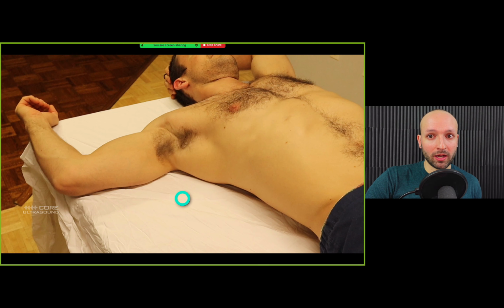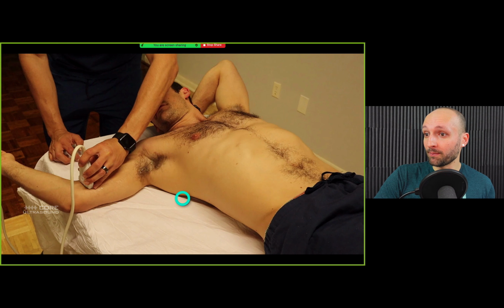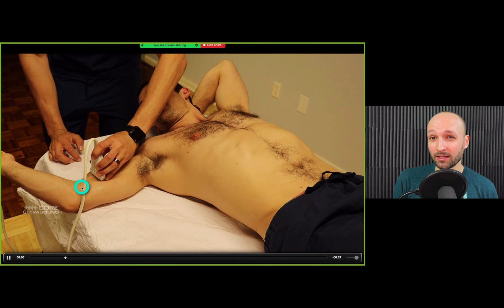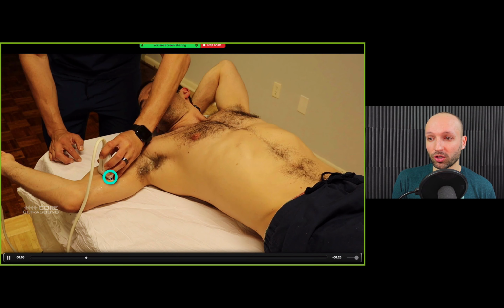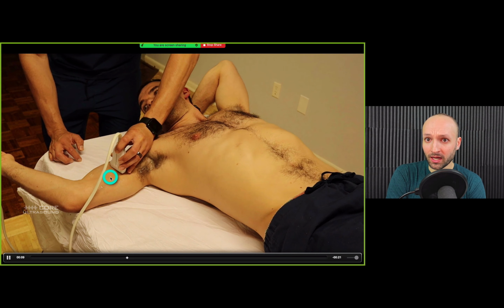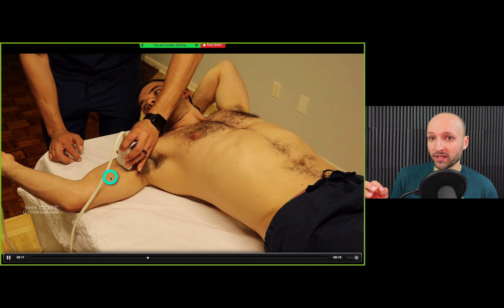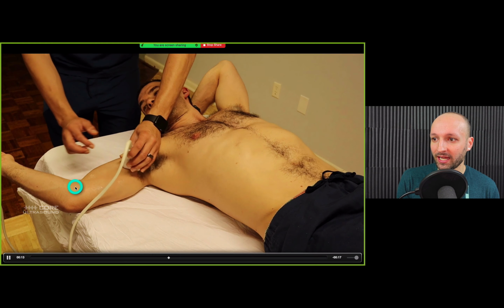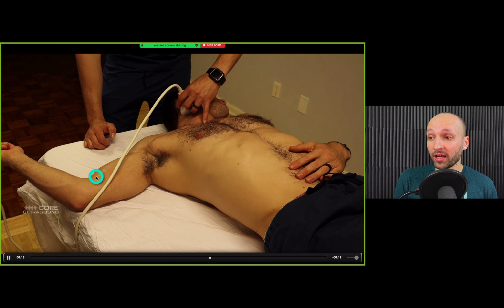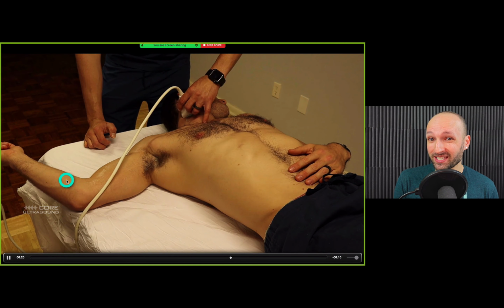I see every once in a while some upper extremity DVT scans being done, which is great. Here's an example of performing an upper extremity examination. I like to start in the brachial and just kind of compress all the way up, just like you would for a DVT. But you can't just look at one spot. You have to at least go down to the antecubital and get all of the brachial vein. And while you're there, go ahead and get the cephalic and the basilic as well.